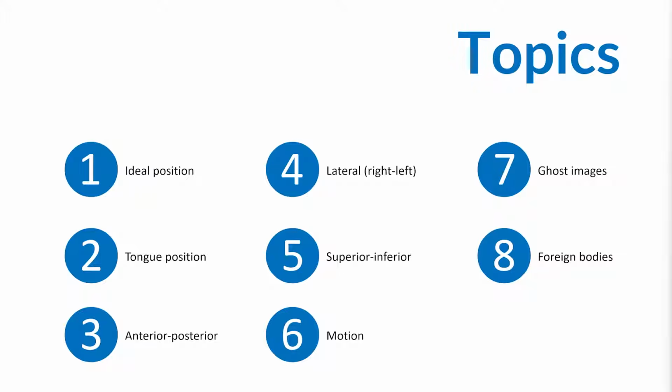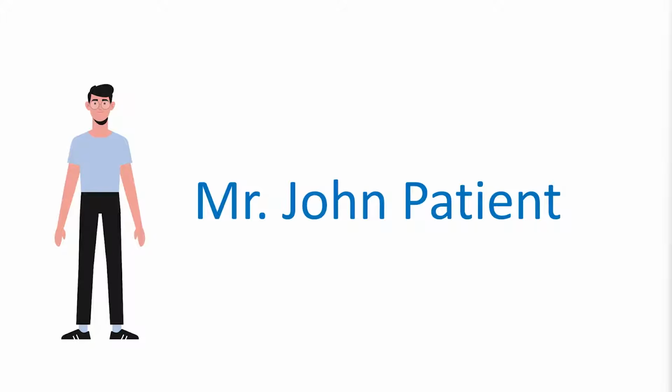Finally, we'll review some common foreign bodies that may be recorded on a panoramic radiograph. Let's meet John. John has arrived at the dental office. He is due for a panoramic radiograph.